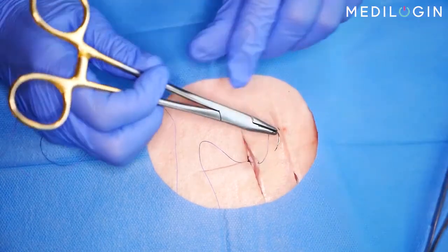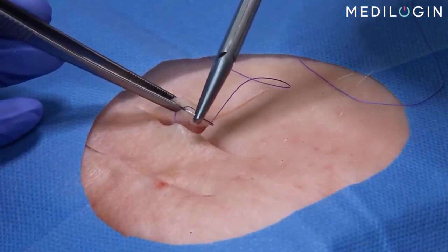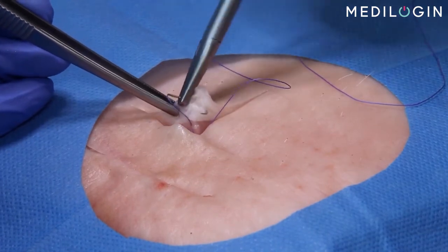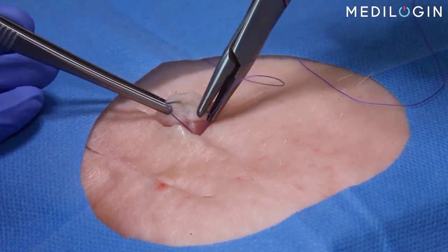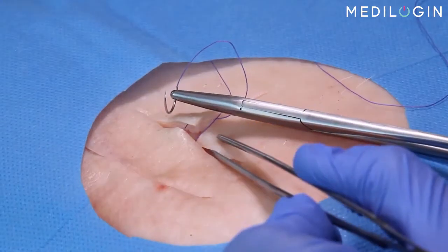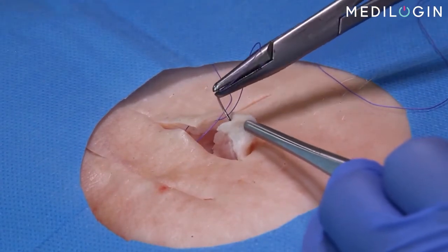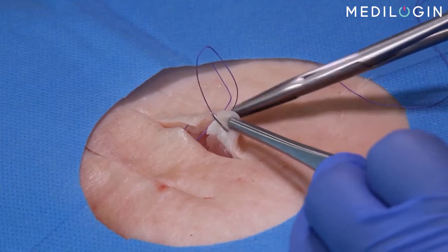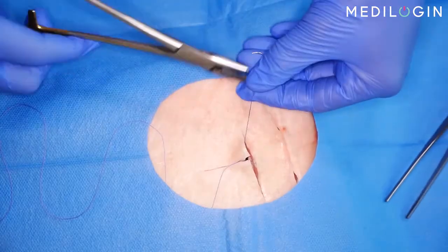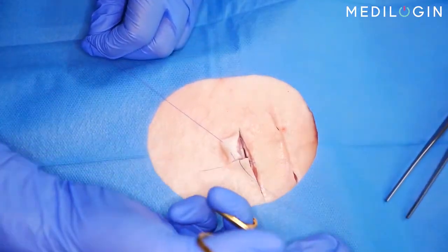The second stitch passes intradermally through the tip of the upper flap, again facilitated by a 180-degree movement of the wrist. Regrasp the needle and insert it intradermally into the tip of the second lower flap. Then draw the suture through the channel and reseat the needle for the final stitch.